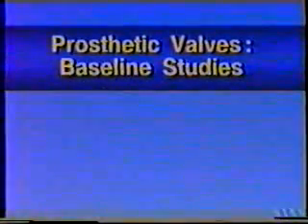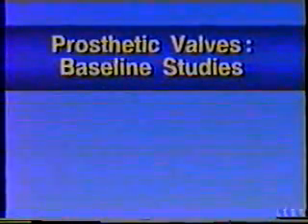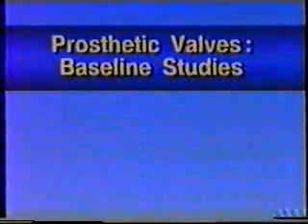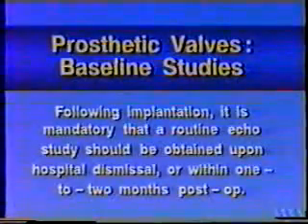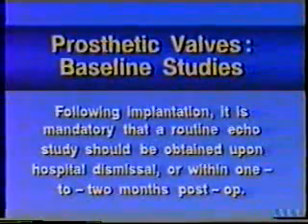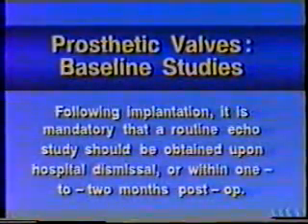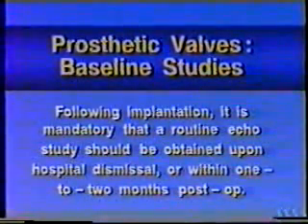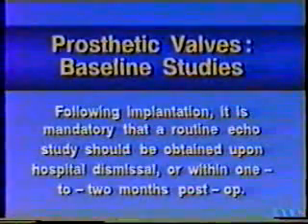Now that we have discussed normal Doppler hemodynamics for prosthetic valves, we must emphasize the importance of obtaining baseline studies for future comparison. Following implantation of a prosthetic valve, it is mandatory that a routine echocardiographic study should be obtained upon hospital dismissal or within the first 1 to 2 months post-op.